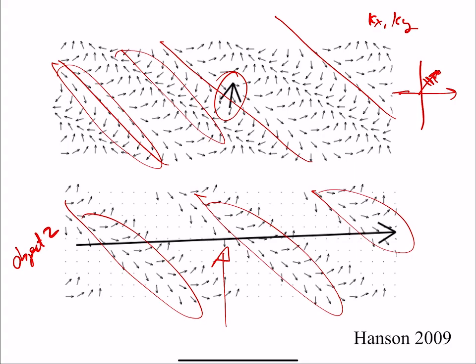Yeah, so the example is, there are lots of different objects in the world. If you have different objects, you're going to have different Fourier transforms. If I image a Belgian waffle, that has a lot of patterns in it, it's going to have a different Fourier transform than a pancake. These are just two different objects you can have. If I have a brain with a tumor and a brain without a tumor, they're going to have different Fourier transforms. If they didn't, then this would be really useless.